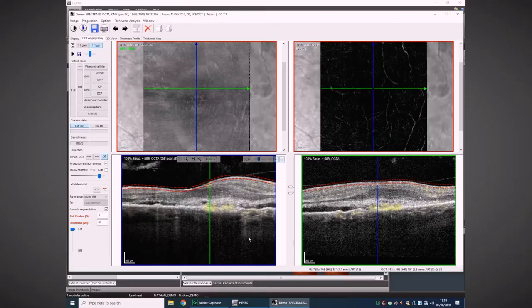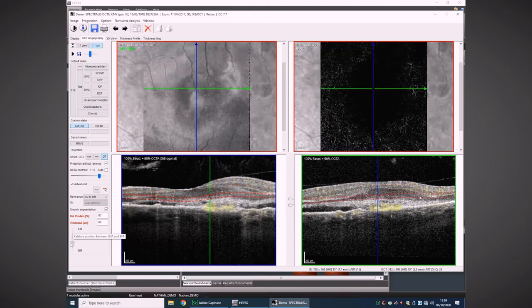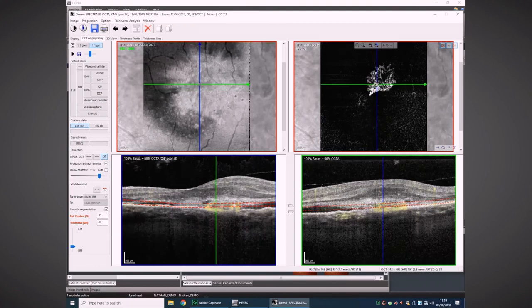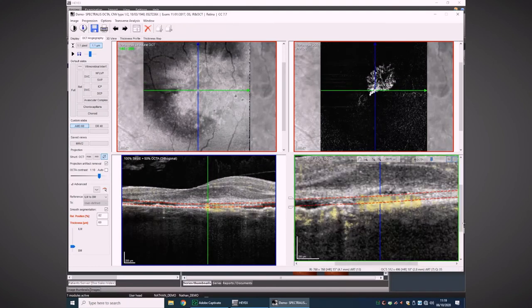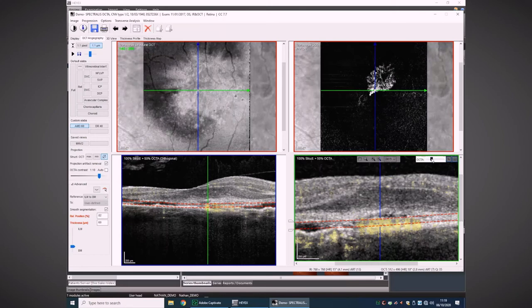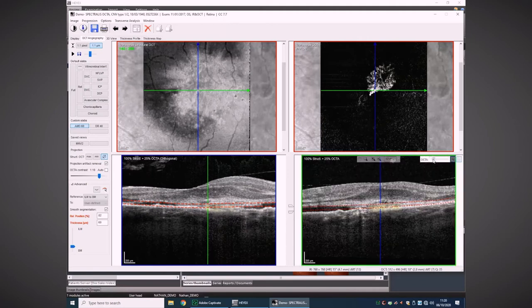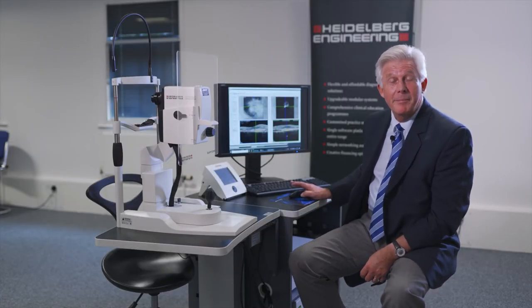Now we're going to walk around the retina three-dimensionally, thinking like a radiologist rather than an ophthalmologist. I've selected my AMD 60-micron slab and I can walk down through the retina into the vascular complex, starting to see where the initial lesion is and where the flow is. You can magnify the structural B-scan with the flow overlay — flow is shown in yellow — and you can remove or add the flow back in. Adjusting between the structural B-scan and the flow, you can see where that flow is located; it's probably above the level of the RPE, suggesting a type 2 MNV lesion.